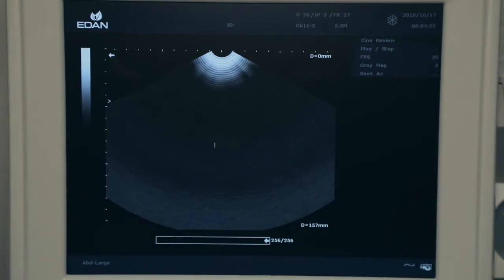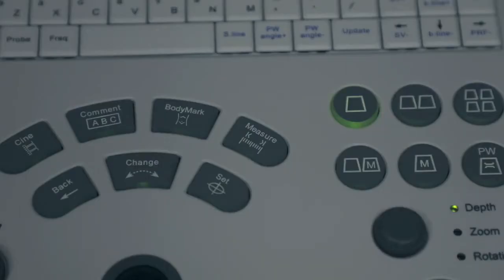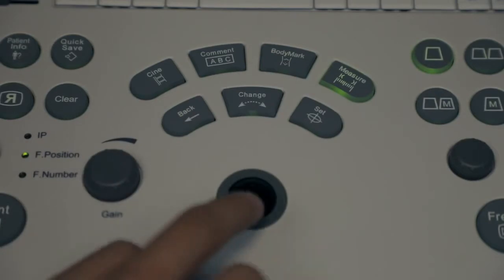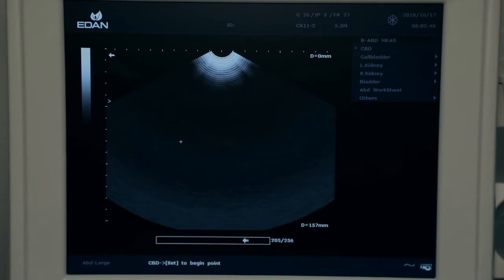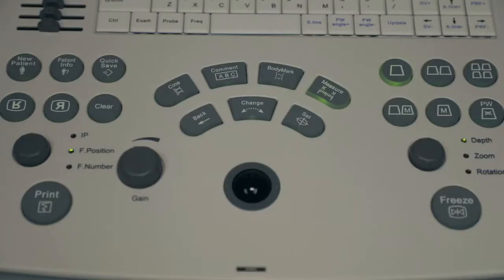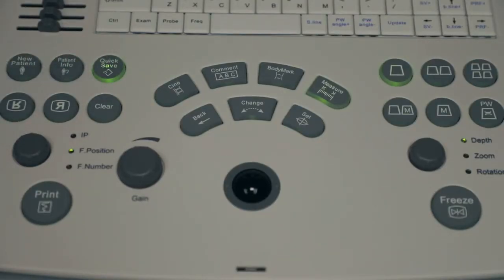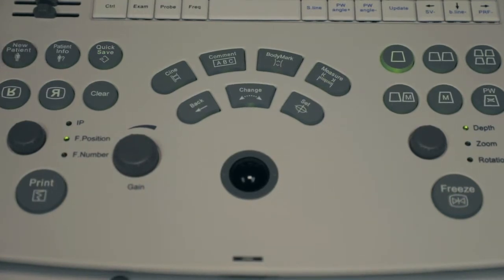To measure, press measure key to enter measurement, move trackball and set to finish measurement. To save image, press quick save. To end exam, press new patient.